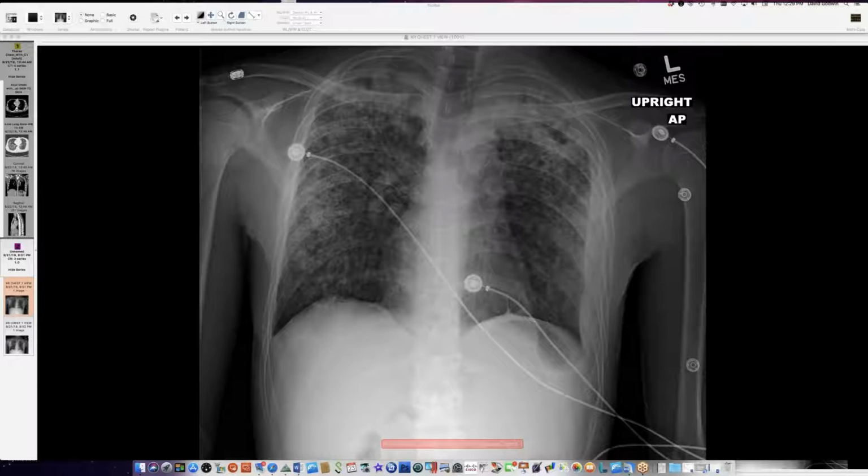So this is a fresh case. This person just came to Harborview. Has a history of a couple of months of fever, weight loss, night sweats, and has this abnormal chest radiograph. We can all see the radiograph, correct?